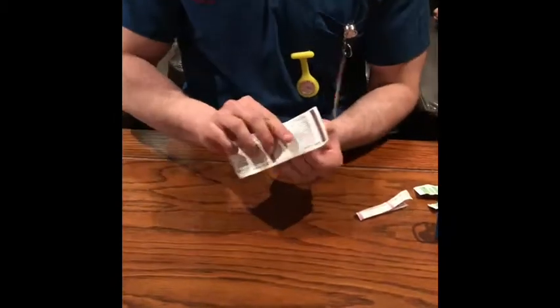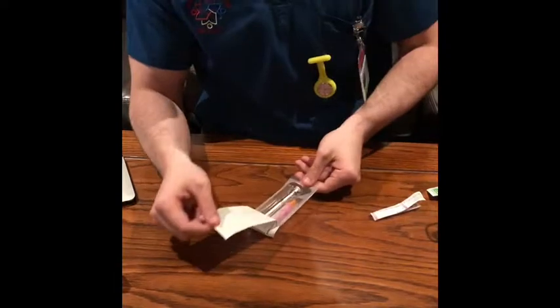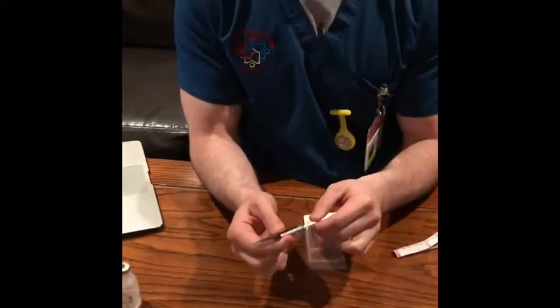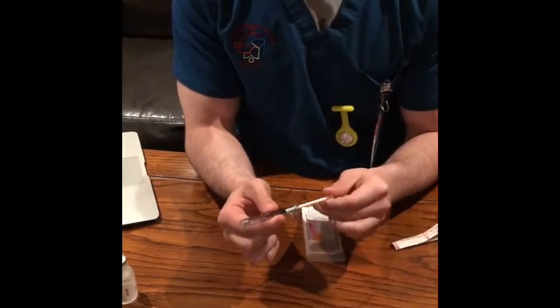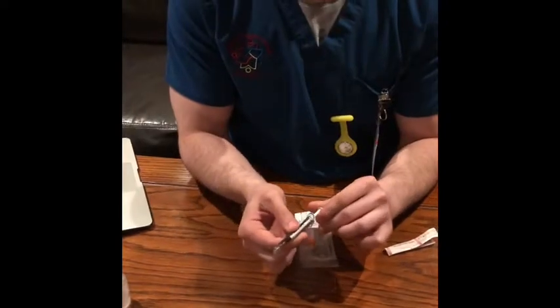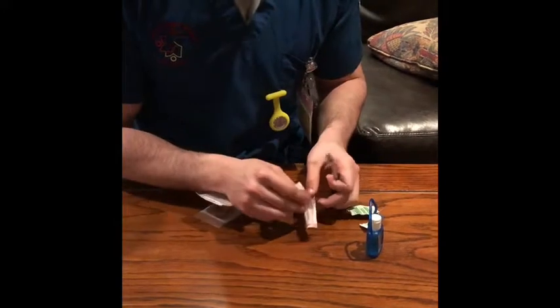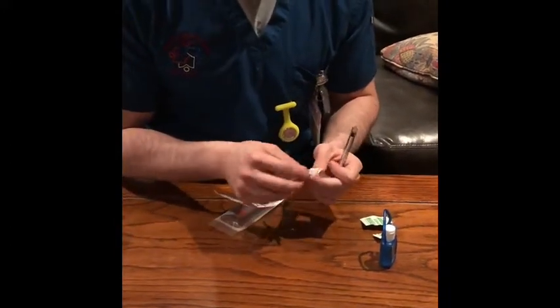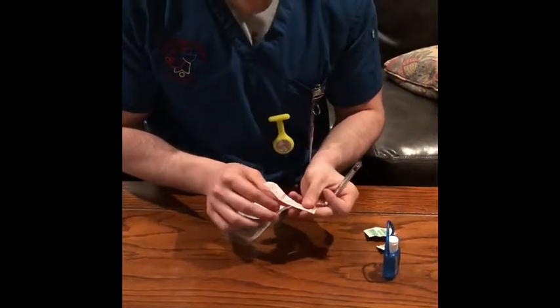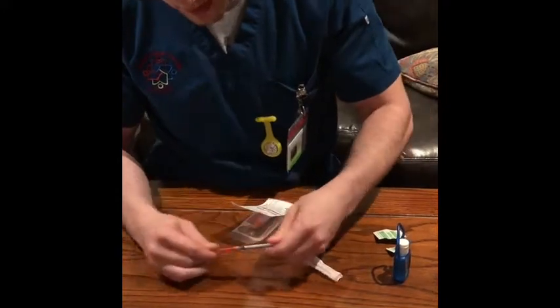First we can open the syringe, top to bottom, banana, with the paper side up. And then we pull the actual syringe itself out, pulling back the plunger and testing to make sure that it works fine before we assemble it. And then to actually draw our medications, we'll be using a filtration needle. So just be sure not to touch the top there. Pull that out.